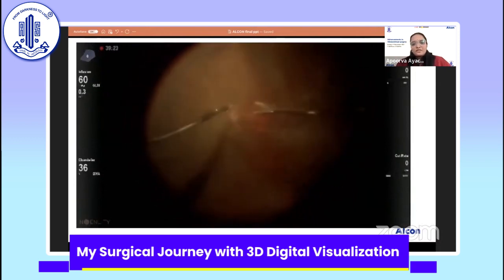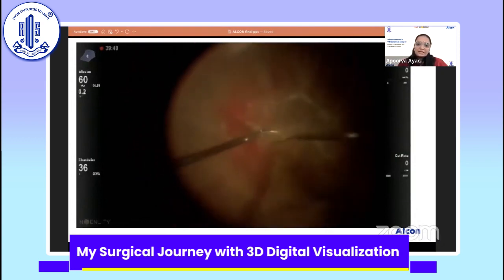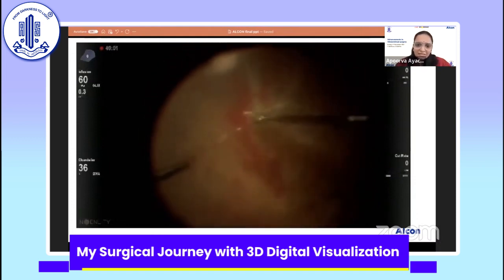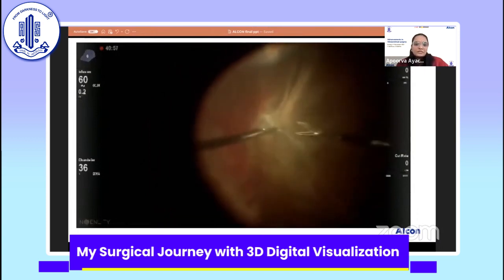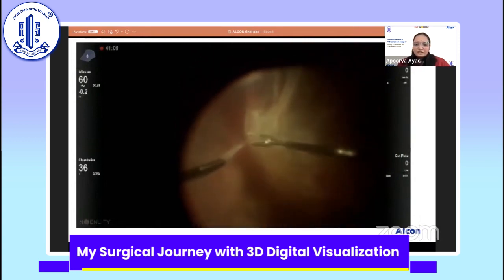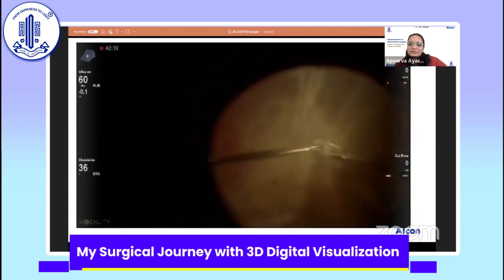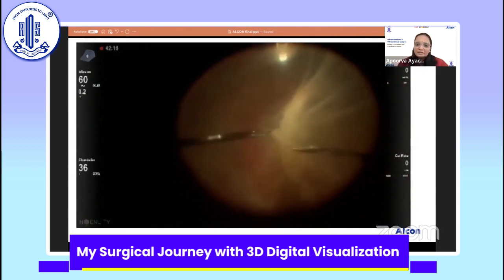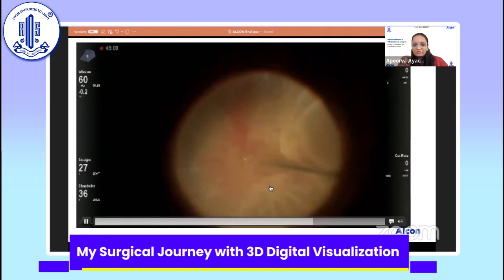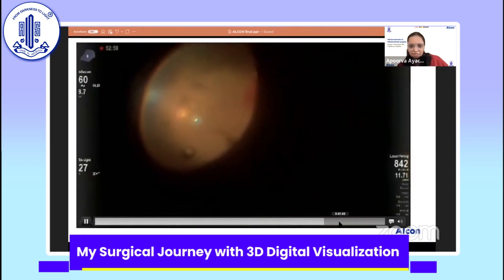Most of us young surgeons are a little impatient compared to our seniors, in the sense that I have seen over the months and years that I have been operating, that when I am attacking a certain membrane, there's not much mindfulness about what is happening a little distance away. So this kind of visualization helps me see what is happening at a distance from the area I'm operating. Here again you can see that I'm cutting here, but there may be distal effects of this action or maneuver I'm doing. So this kind of system really comes in handy at such instances.